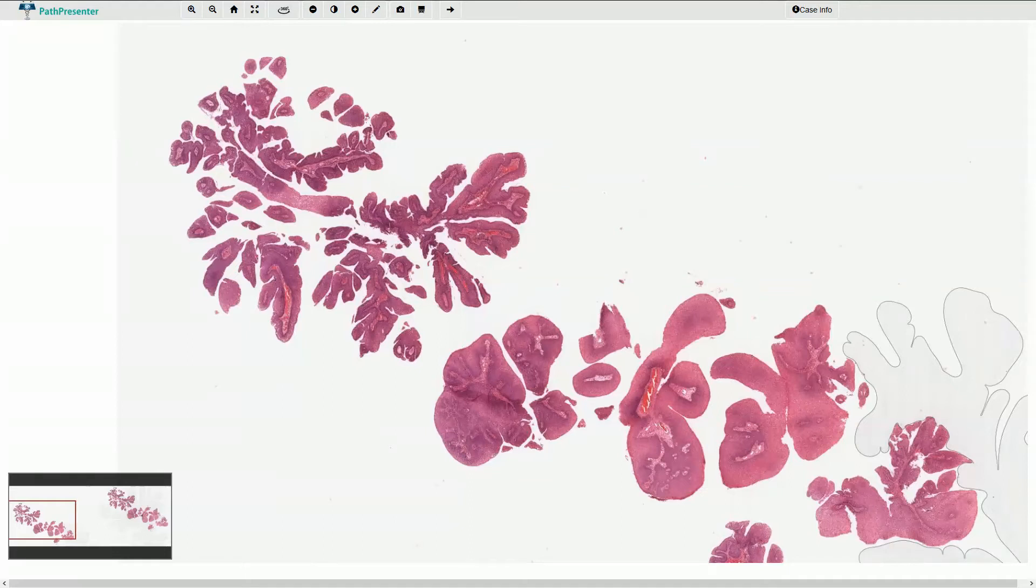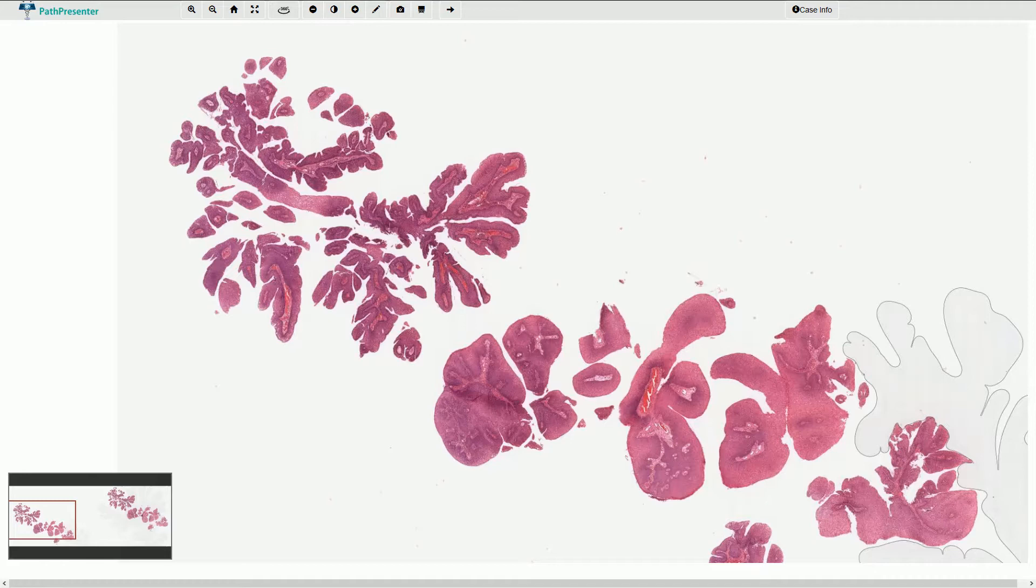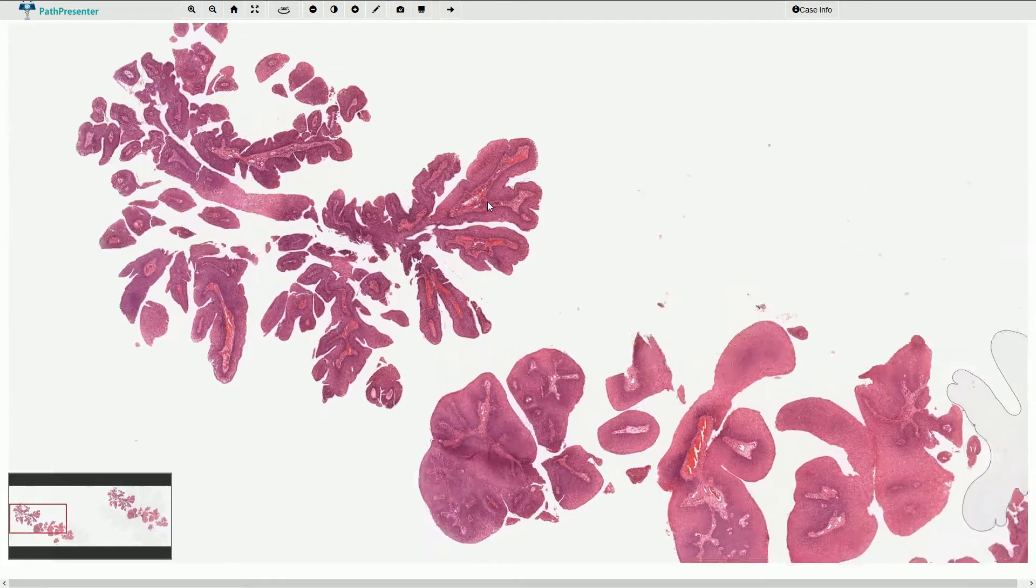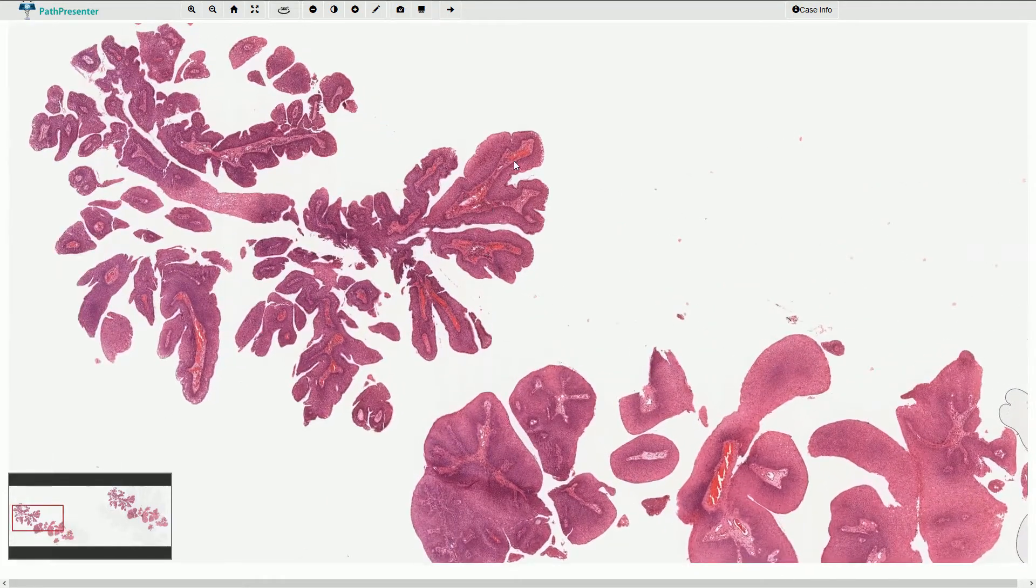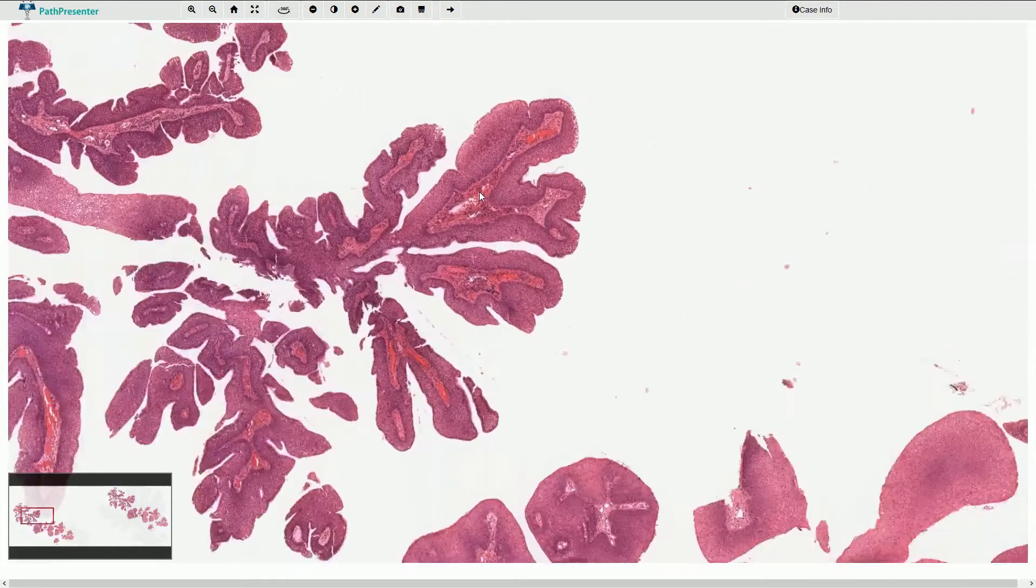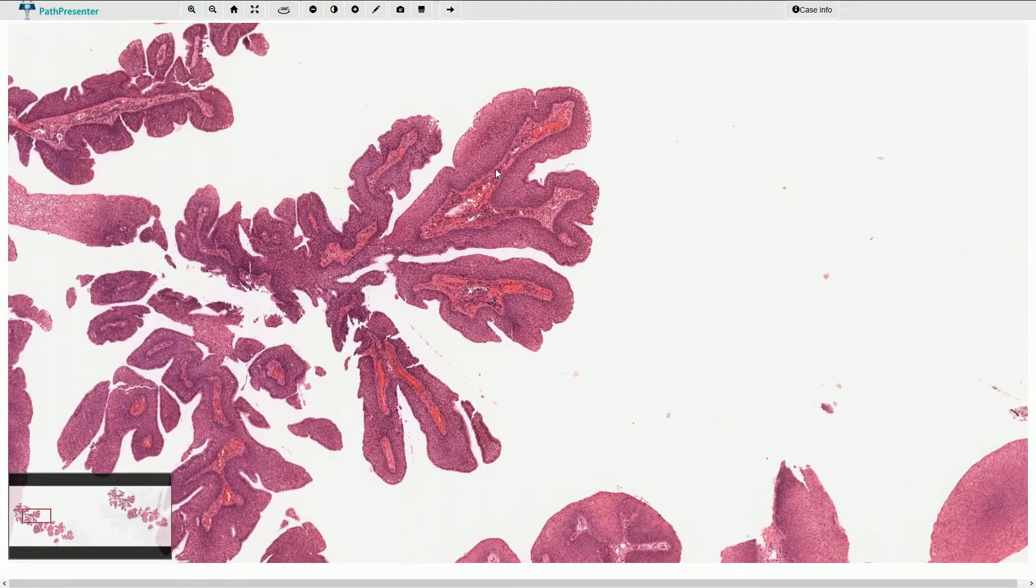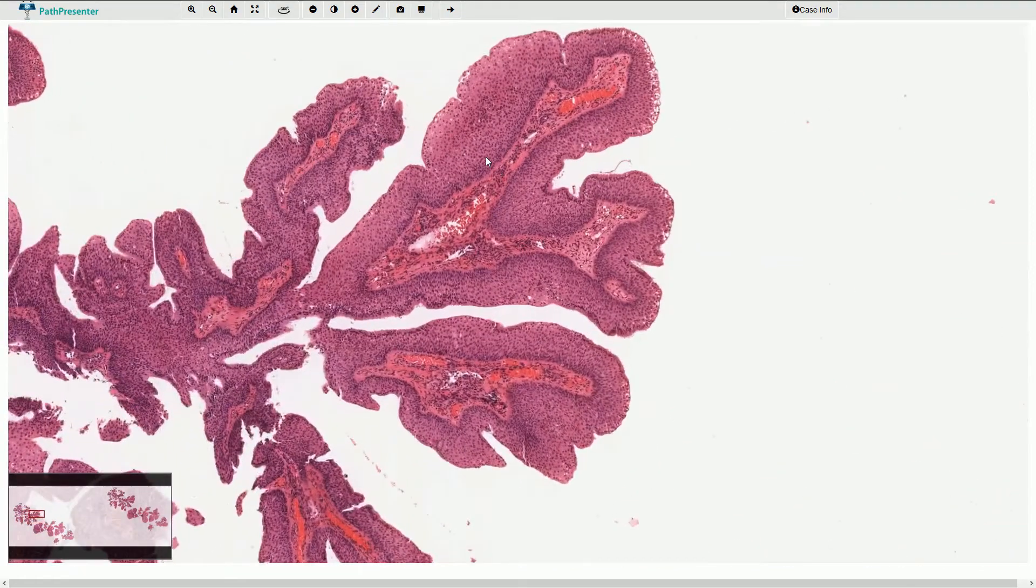Here we have the biopsy of the papillary polypoid lesion of the larynx, consisting of arborizing papillary projections with thin fibrovascular cores lined by non-keratinizing stratified squamous epithelium.